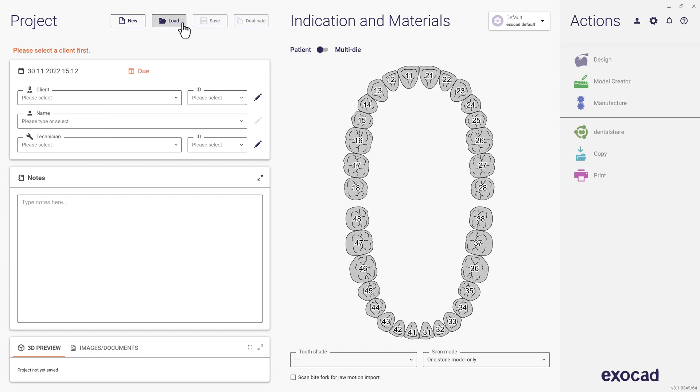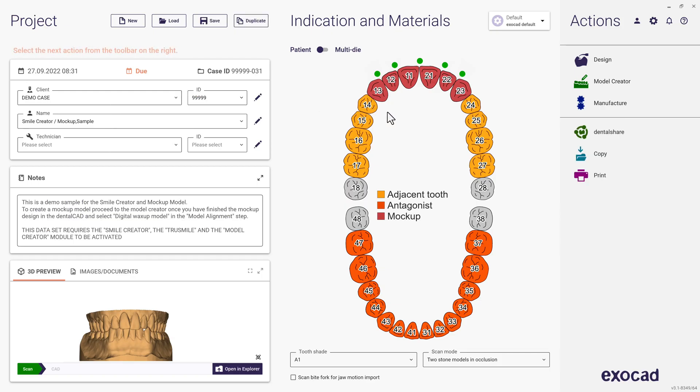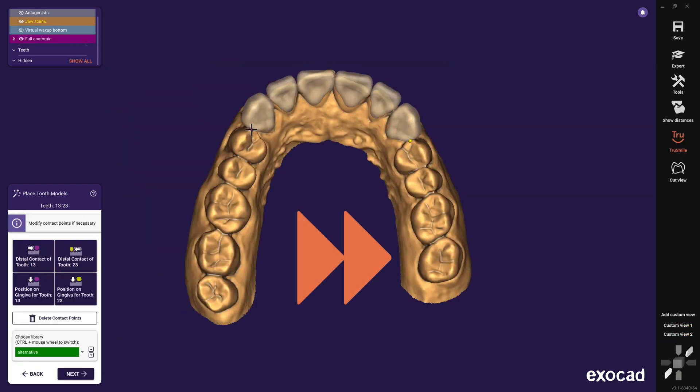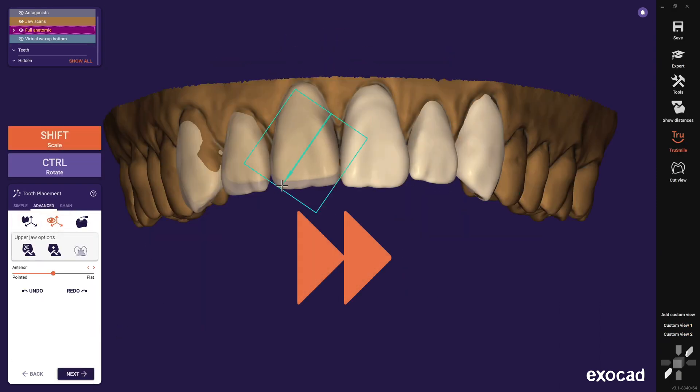Any type of restoration can be used to merge design and model — for example, the mockup and the unprepped model, but also the restoration on a prepped case that I will show you later as well. A click on design starts the mockup workflow from scratch. We already explained the workflow in our previous mockup tutorial step by step in detail, so let's fast forward here until your setup is done.